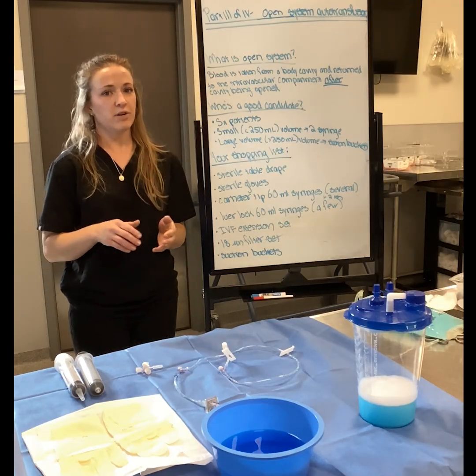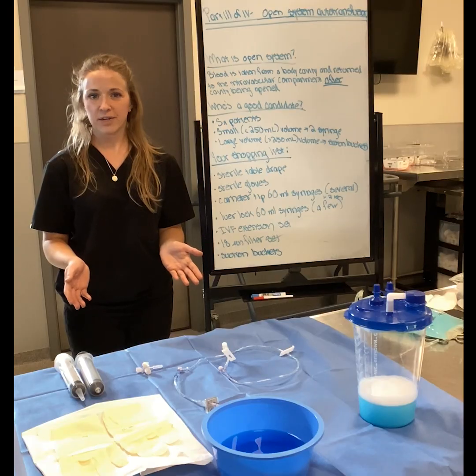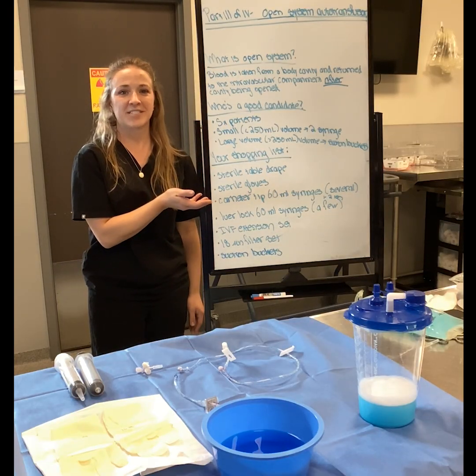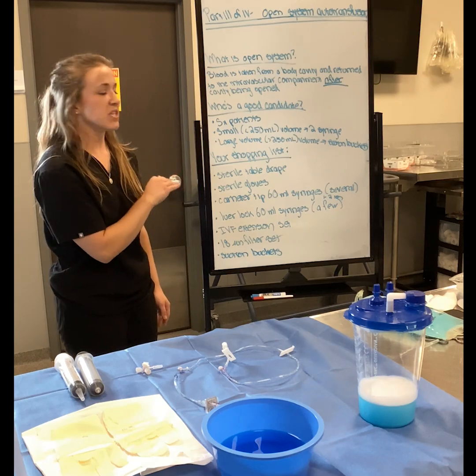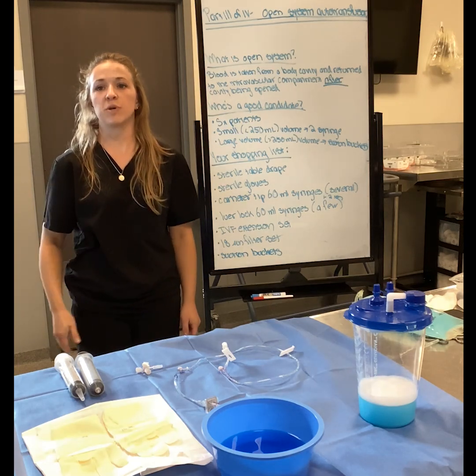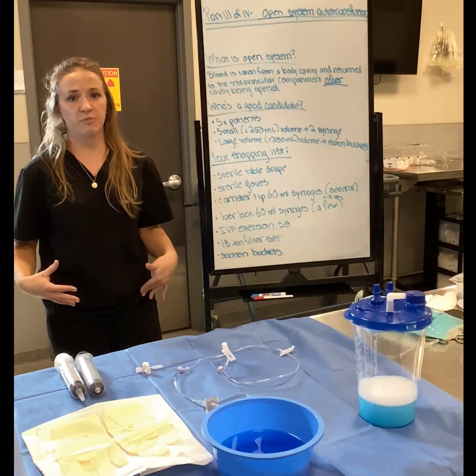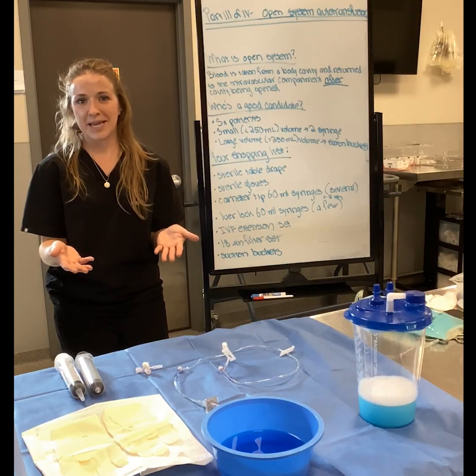That being said, who is going to end up being a good candidate for this? It kind of goes without saying, if it's open, the body cavity has to be opened. This is going to be mostly for surgical patients. So we are doing surgery on the chest, we're doing surgery on the abdomen, and there is a collection of blood there that the patient is really in need of having.